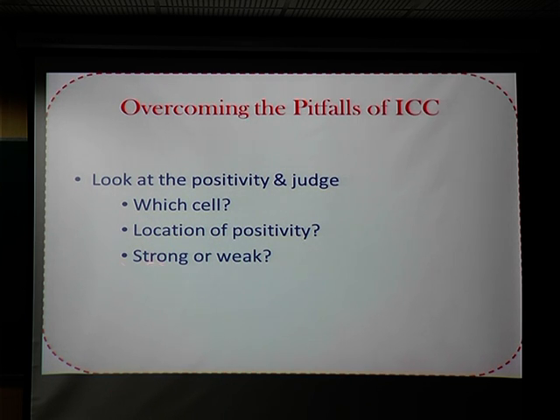Whether the positivity is strong or weak. When we read all journals for this type of cases, you see that the positivity is reported in terms of 1+, 2+, 3+, weak, moderate, strong. So that is a matter of practice. You have to really practice which is weak, which is moderate, which is strong positivity. So that has to be really mastered.